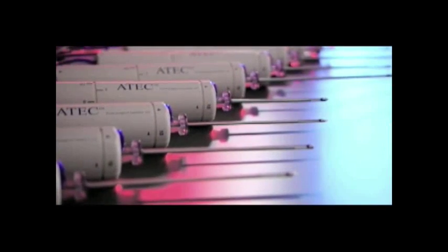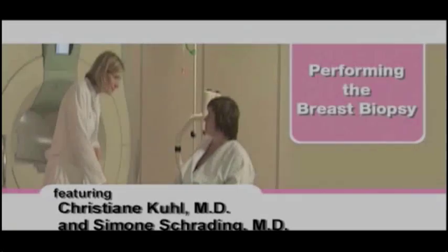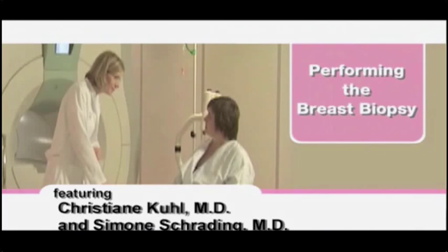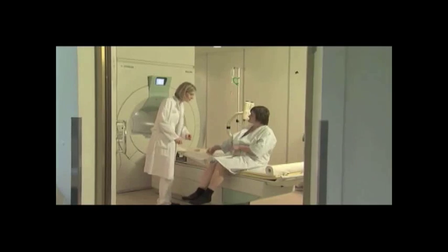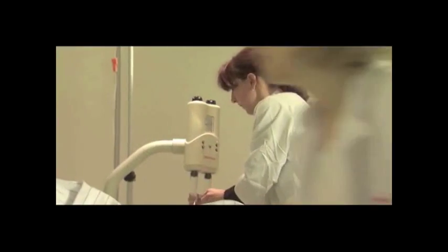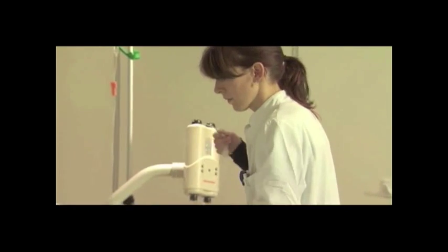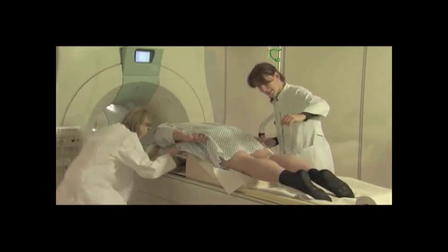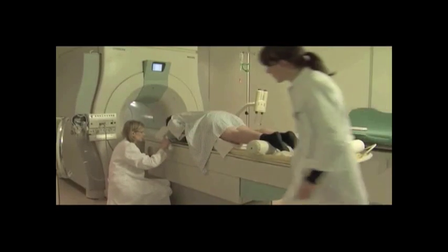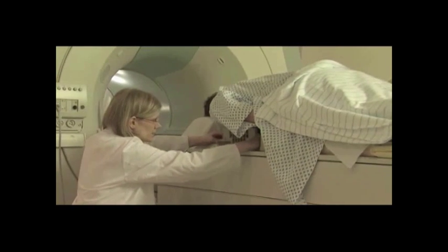The standard Atec MRI handpiece is used during the procedure. Once the patient arrives in the MRI suite, an IV is started to facilitate the injection of the contrast agent to aid in visualization of suspect tissue. The patient should be reminded of the importance of remaining still during the procedure. Clean the patient's breast and position in the breast coil with enough compression to immobilize the breast.